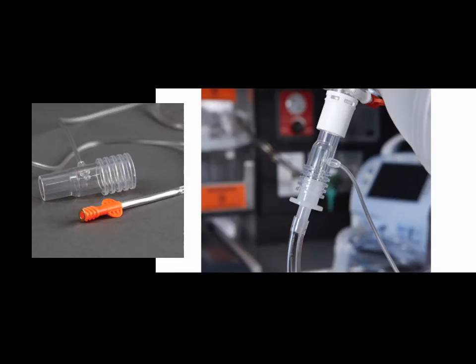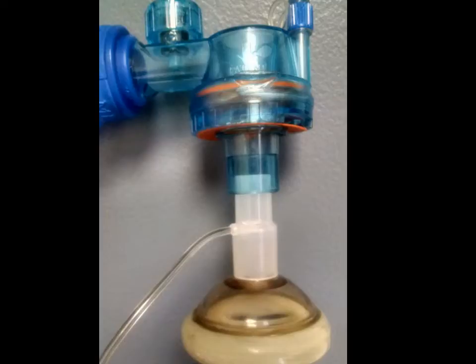We also have the piece that goes on the end of the advanced airway, whether a king or an endotracheal tube in this case. But you can also use it on a BVM, and in this picture you see the BVM with the end tidal or the ET tube adapter piece between the BVM and the mask.